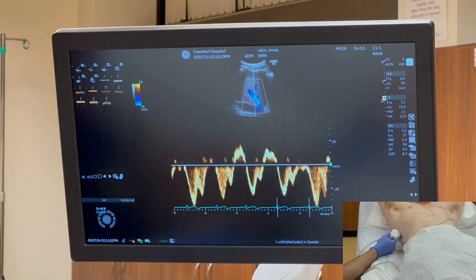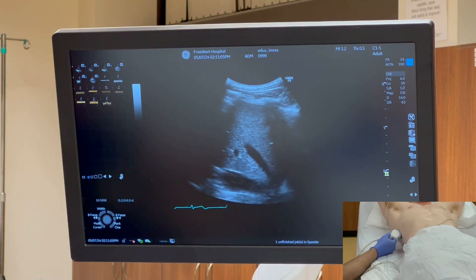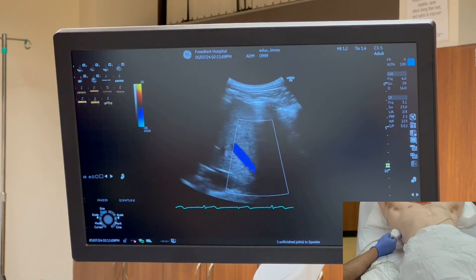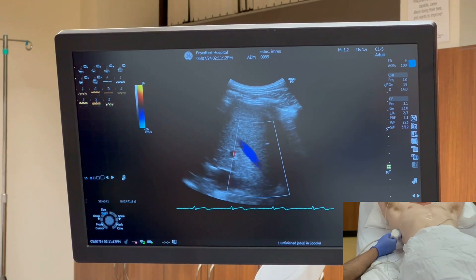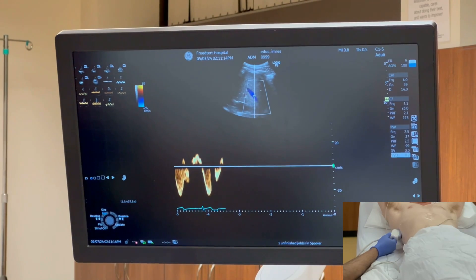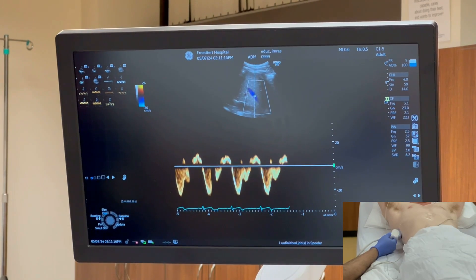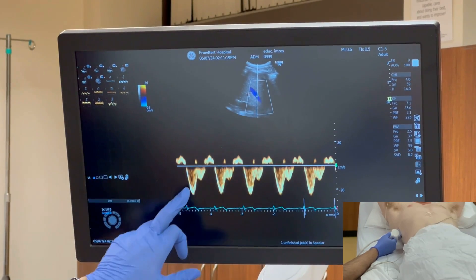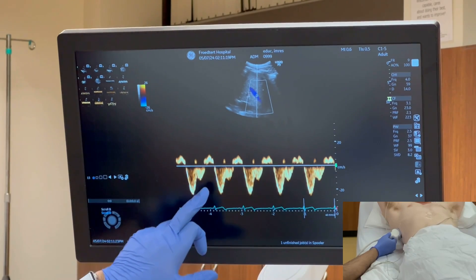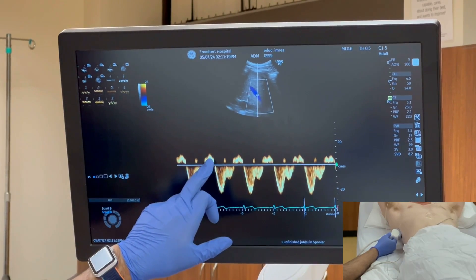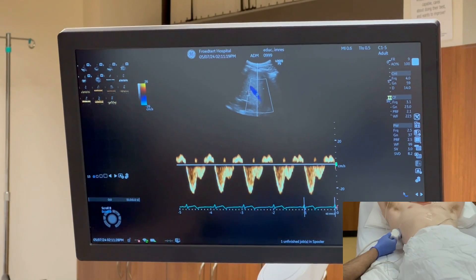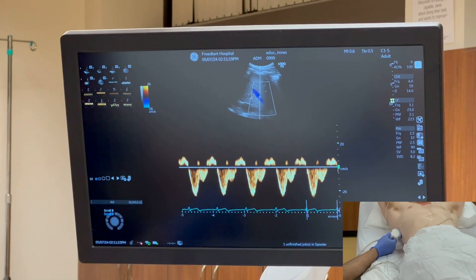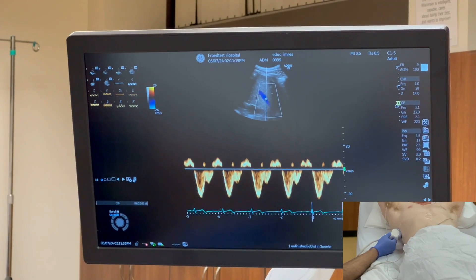We'll get one more waveform with the patient holding their breath — that way it appears more uniform. Once we find the vessel, we ask the patient to hold their breath. Now the waveform is much more uniform. You have the systolic wave followed by the V wave, the diastolic wave, and the A wave. Make sure the patient doesn't perform a Valsalva maneuver inadvertently, because that would blunt your waveform.